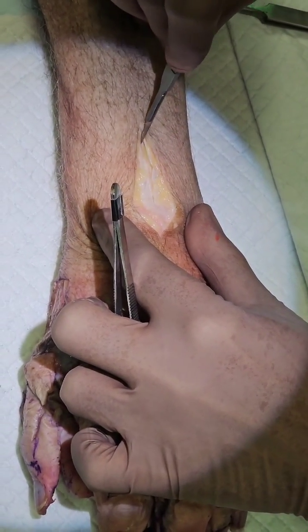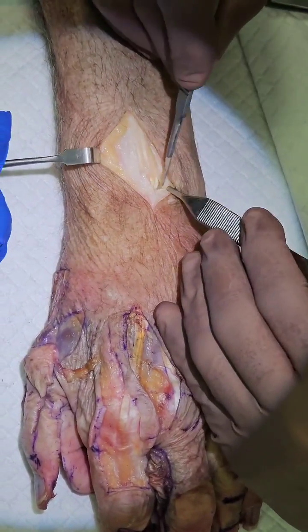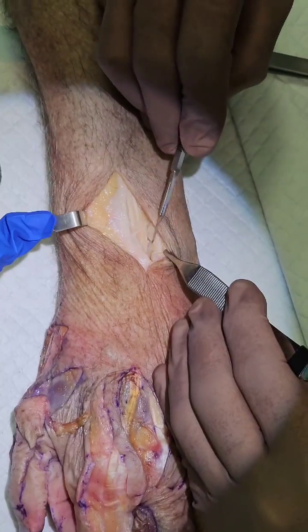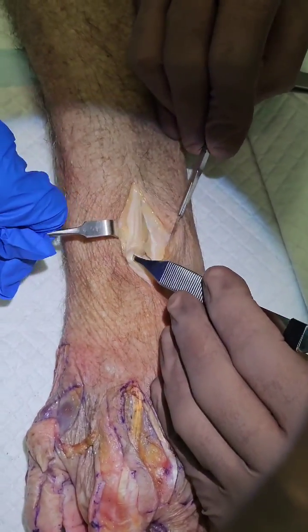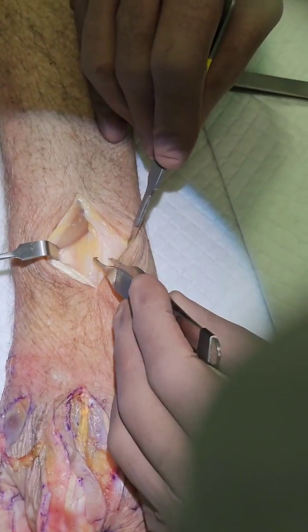Go to the fourth compartment. Somebody retract for me. So this is the fourth compartment — open the retinaculum. You can see this is the fourth compartment; there are many tendons there. Pull that away, pull here.